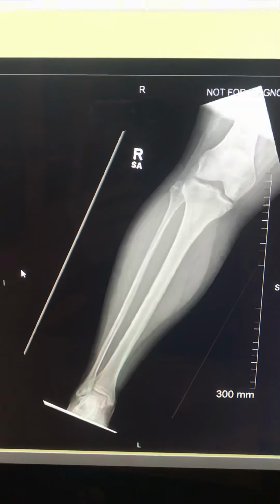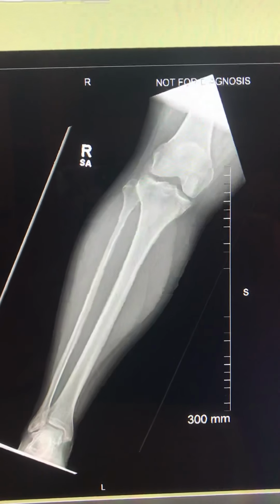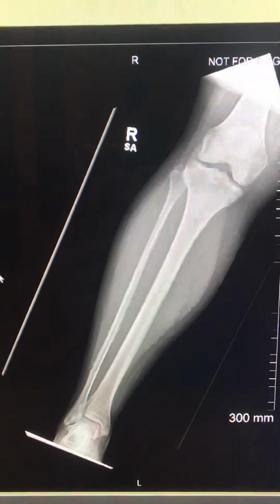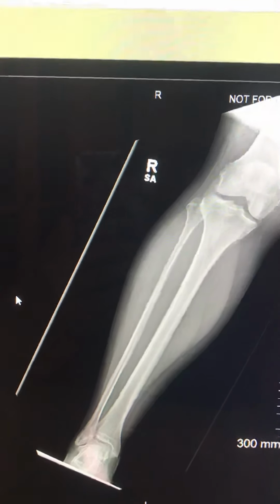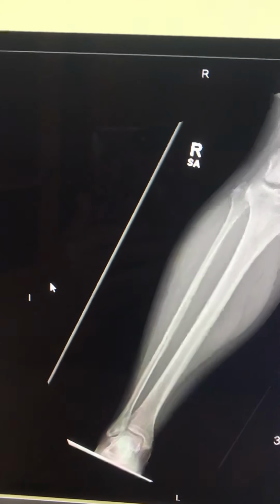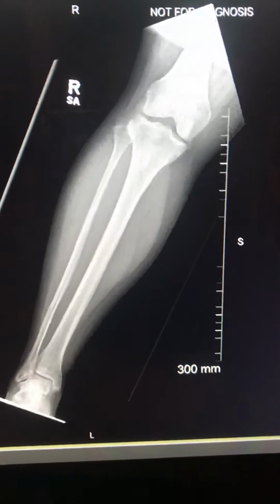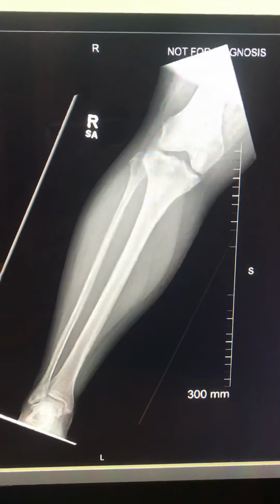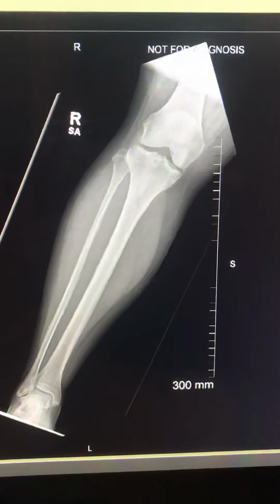The image exposure for the AP: the brightness on the image shows soft tissue margins and trabecular markings. Equal brightness seen on image. Exposure is diagnostic quality. Patient was able to extend her leg out and lay it flat on the image receptor. The IR was placed underneath the tib fib. It was tabletop on the gurney.